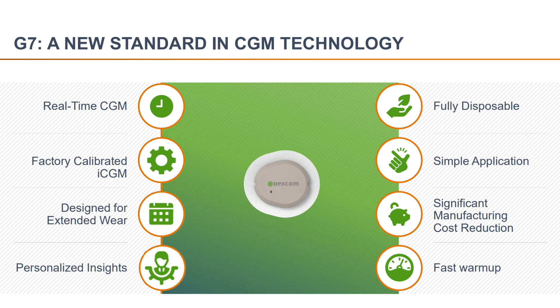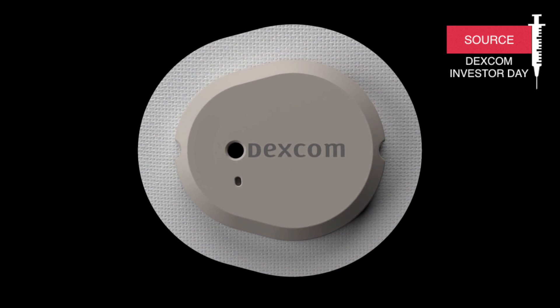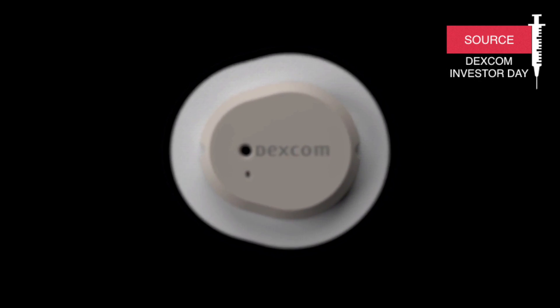The G7 will be fully disposable and will be 60% smaller than the G6. On top of that, the G7 will not need a separate transmitter — the transmitter will be built in. So hopefully Dexcom is finally catching up with Libre, which is way easier to apply right now.